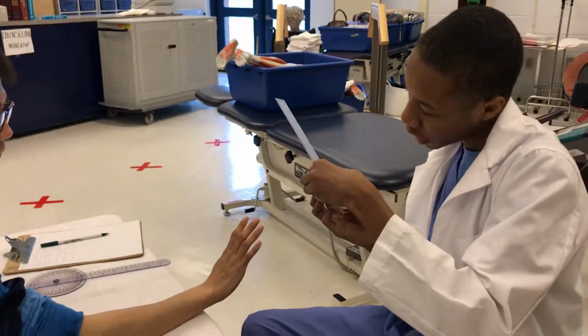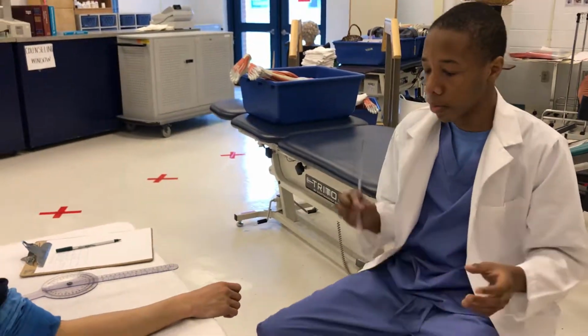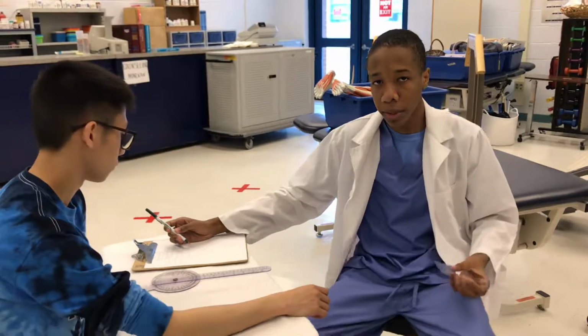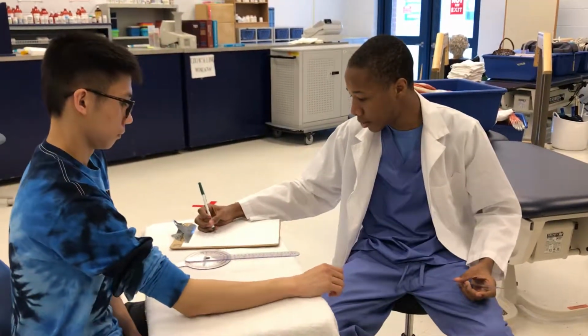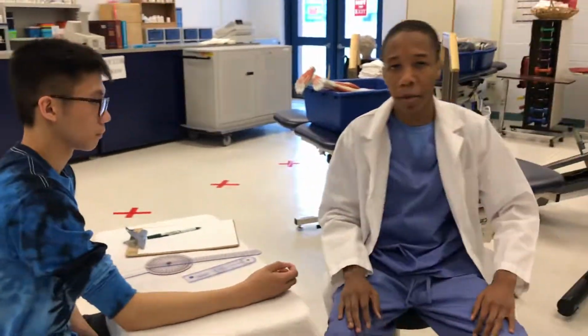So the patient had 42 degrees wrist extension, which is kind of under normal. Normal would be about 80, but he did have an injury on this arm, so that is expected. Log it there. And now I'm done with the goniometry.